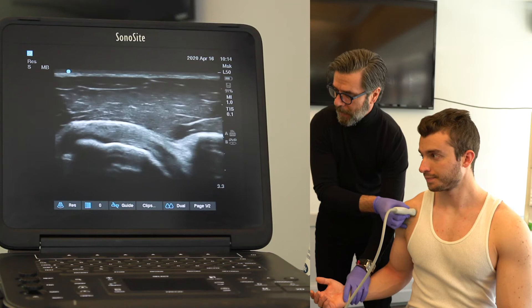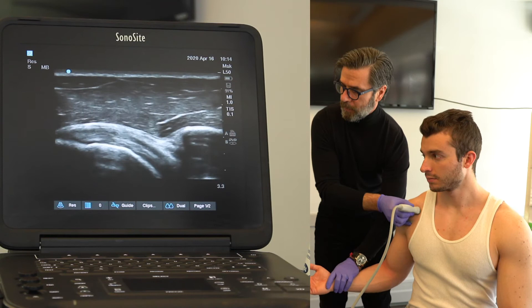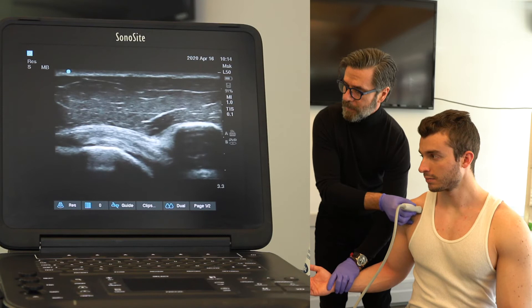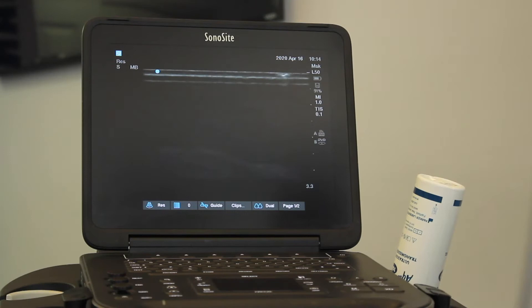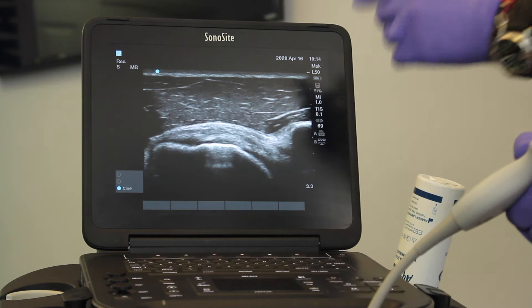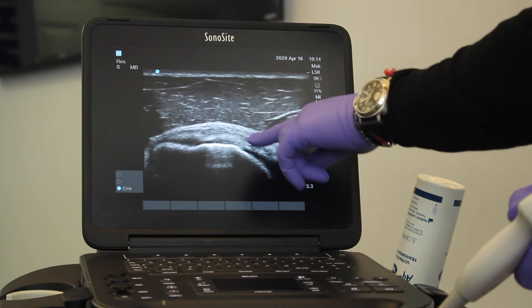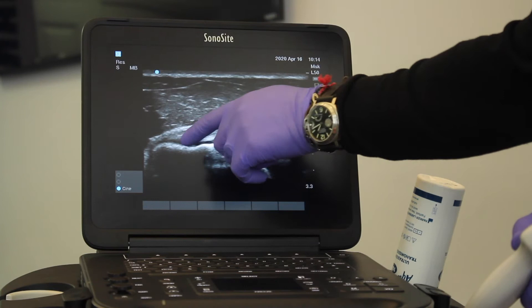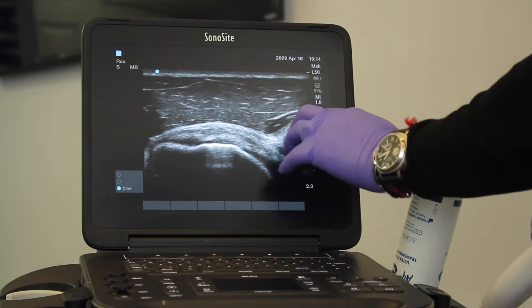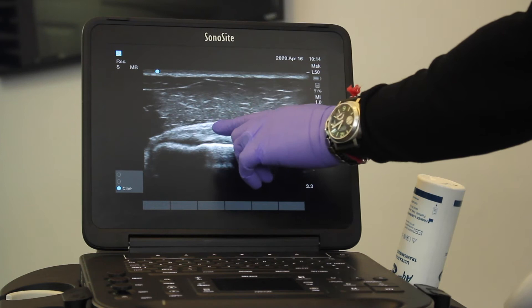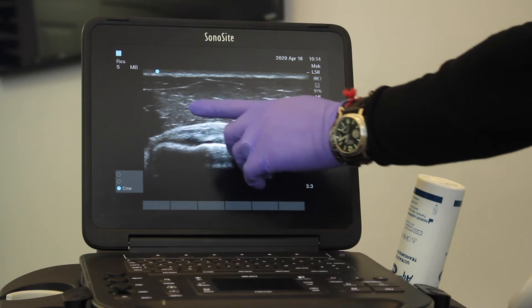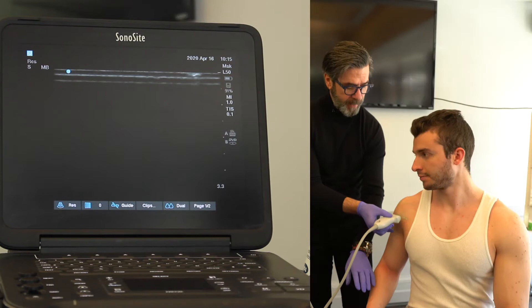For the subscapularis, I'm going to first scan in short axis and rotate the arm in external and internal rotation while watching the tendon. Scanning the subscapularis requires external rotation. You can see this very healthy subscapularis tendon — you can see how it grabs the bone at the attachment, and here is the coracoid process. I'm looking purely at the quality of the tendon, and this is a very healthy tendon with no problems.